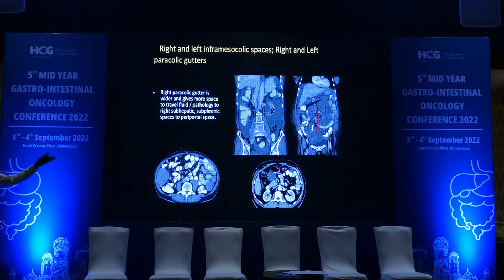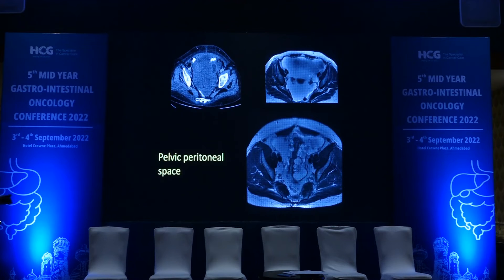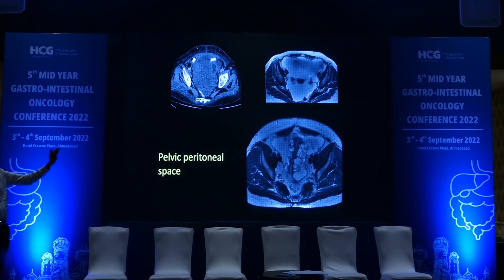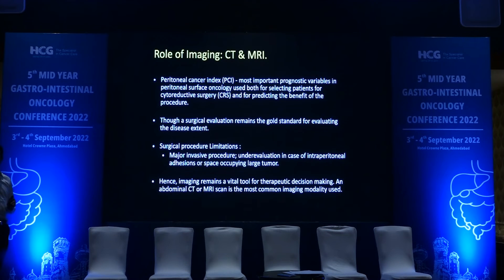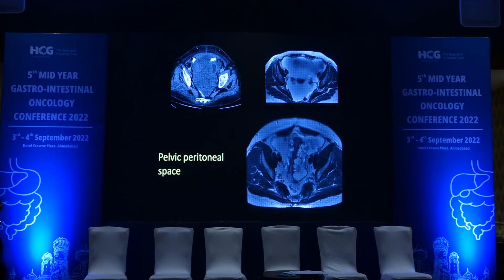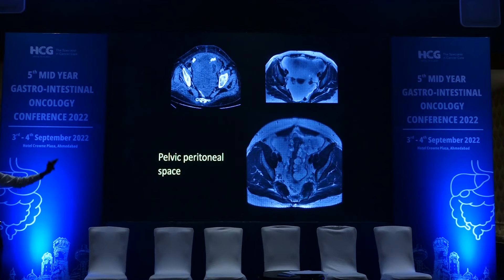Here are a few images of solid as well as cystic deposits in appendicular malignancies. Can you identify which is solid, which is mucinous, and which is purely ascitic? The first is solid deposits with encasement of the adjacent sigmoid loop; you can see the bladder, cystic cavity, and ileal loop. The second is purely ascitic. The third is a mucinous deposit. This demonstrates the beauty of MRI — you can easily differentiate between mucin and fluid.